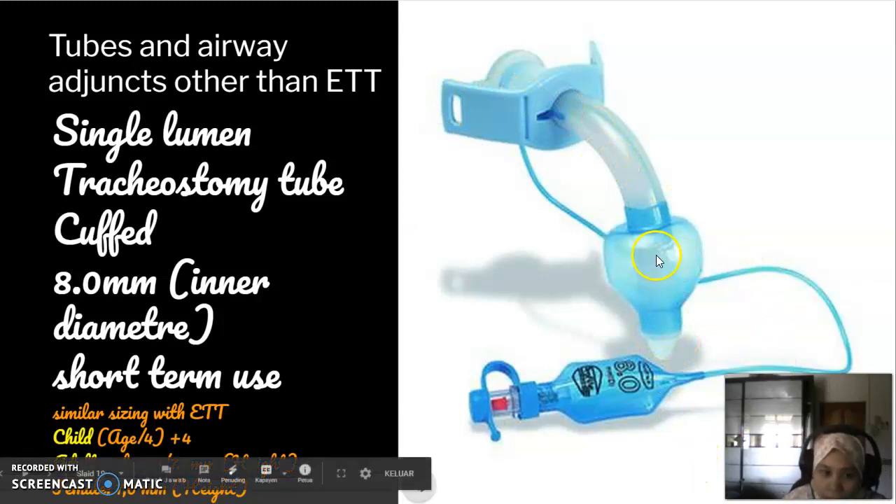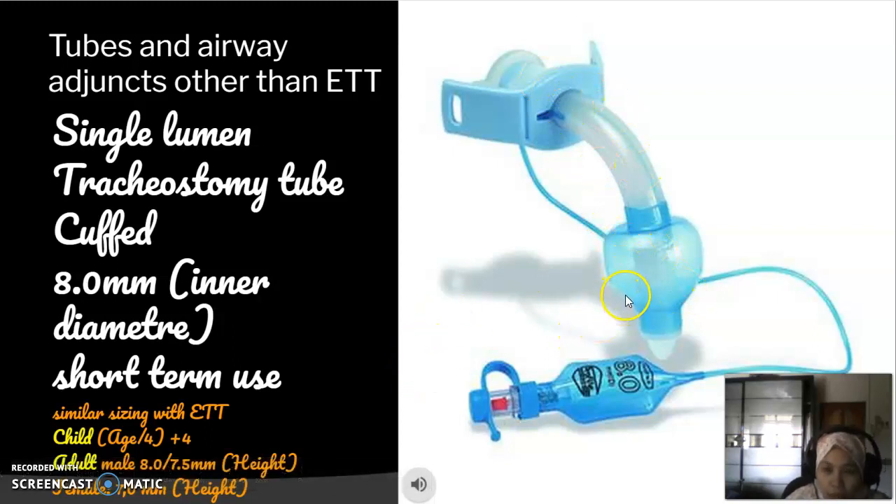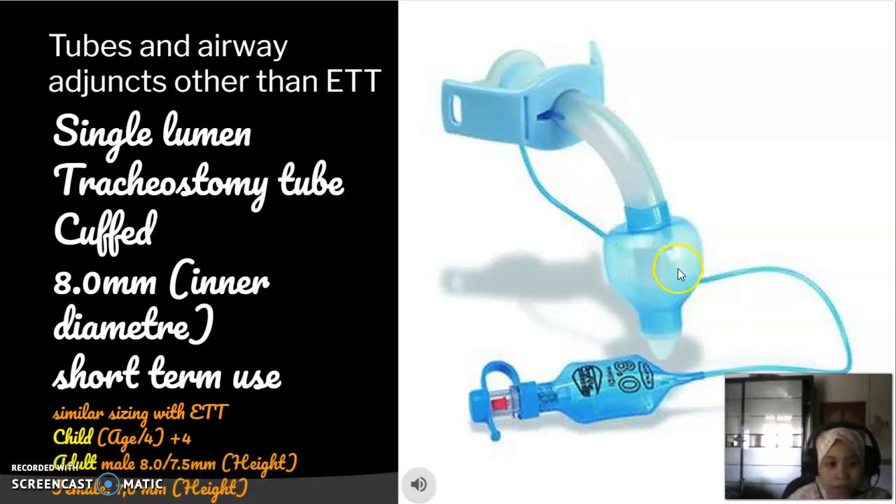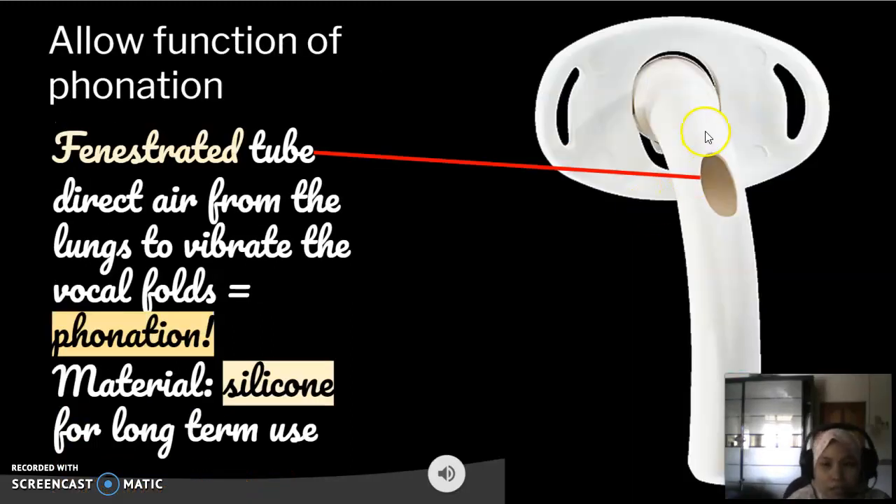Sizing of a tracheostomy tube is similar to sizing an endotracheal tube. This is the general formula used to size endotracheal tubes in both children and adults. To describe this particular tube: it is a size 8 millimeter single lumen tracheostomy tube, it is cuffed, it is made of PVC, and it is meant for short-term use.